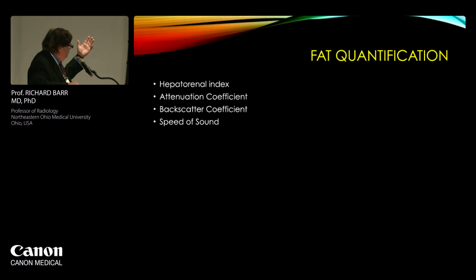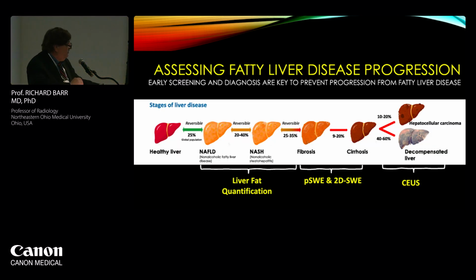It's been around for almost as long as I have been. Attenuation coefficient, backscatter coefficient, and speed of sound, which the PICAS group is looking at, all of these. Most vendors now have attenuation coefficient. I think it's pretty useful. And again, Dr. Ferrioli will give you an update on all of that.